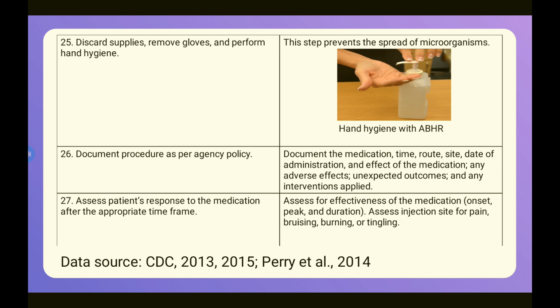Number 25. Discard the supplies, remove the gloves, and perform hand hygiene. This step prevents the spread of microorganisms and protects you and the patient. Hand hygiene with alcohol-based hand rub, as you see in the image.